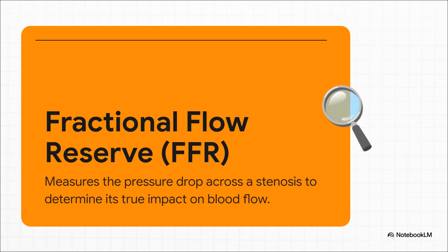But here's an even more important question. Just because a blockage is there, is it actually causing a problem? Is it limiting blood flow? That's the question FFR answers. We use a special pressure wire to measure the pressure drop across the blockage. This tells us the true physiological impact of that narrowing, which is often more important than just how it looks.